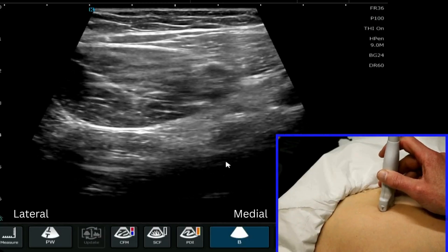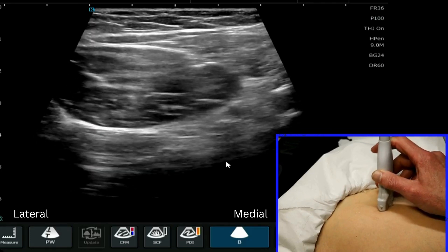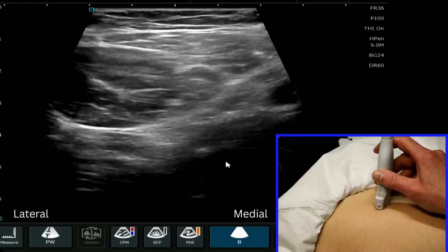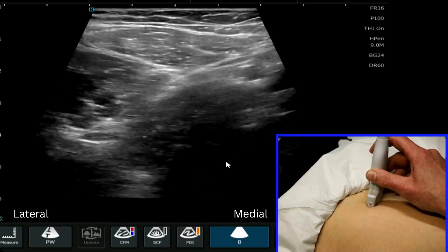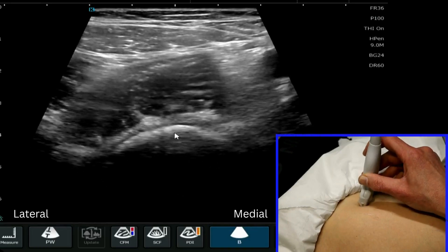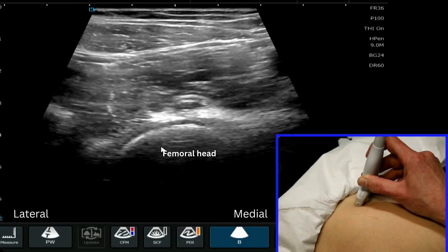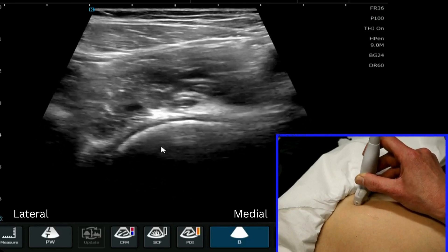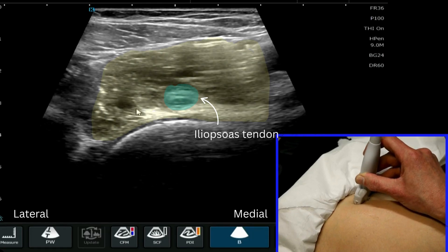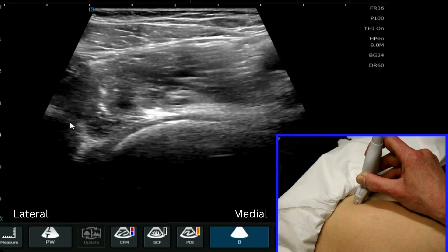We have the proximal anterior thigh and we're going to scan for the hip joint. My probe is placed roughly centrally on the thigh and I'm going to move in a proximal direction until I see a bony contour — that's the femoral head. When we have found the femoral head, we firmly place that into the center of the image, and then we can see the iliopsoas muscle lying over here, which is your reference point where you can see it very clearly.